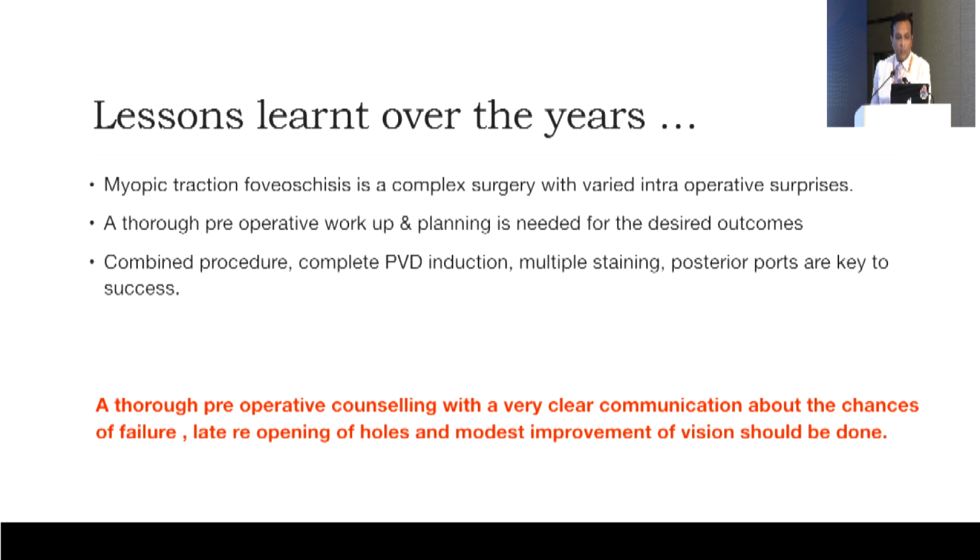Multiple steps are useful in the surgeries, like doing a phaco-vitrectomy, doing PVD inductions with the combination of dyes, multiple stainings for a longer time, posterior ports. But the bottom line is a thorough pre-operative counseling with a very clear communication about the chances of failure, reopening of holes, and modest improvement of vision should be done to the patient and their relatives.